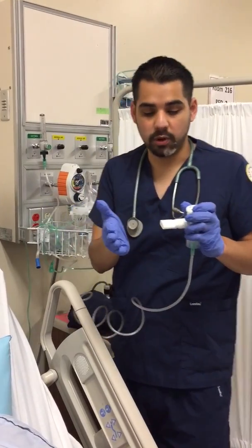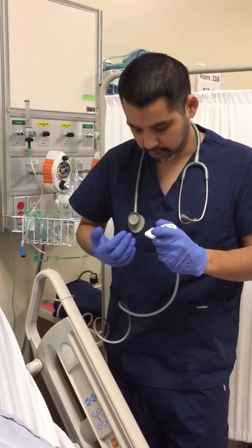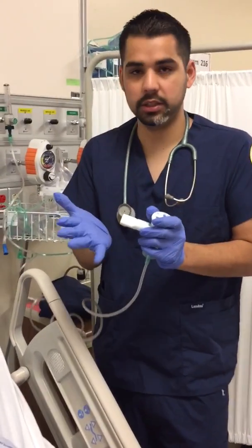And then you'll see when it's working, you'll be seeing a mist coming off. Once you see the mist, you can always check by putting it against your scrubs or your hand, because they're blue. The mist will come out clear and white. If you see the mist, that means it's ready to be given.